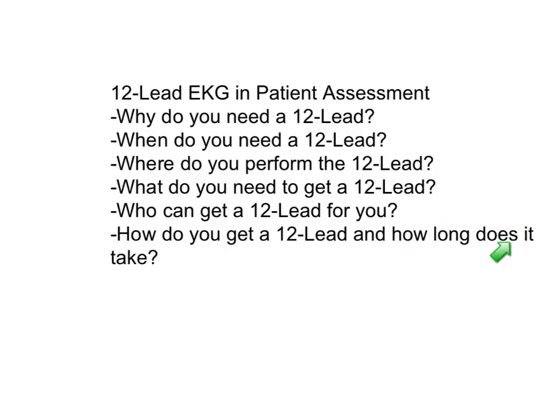How do you get a 12-lead? How long does it take? Pretty simple to acquire one. Again, hook up the wires, have your patient remain still, try to minimize any movement, push the 12-lead button on the monitor, and it will take about 10 or 15 seconds. How long does it really take, start to finish? Probably 2 or 3 minutes. If you're working on it rapidly, 2 or 3 minutes from the time you decide you need one until you have the printout. So again, just kind of a quick overview.